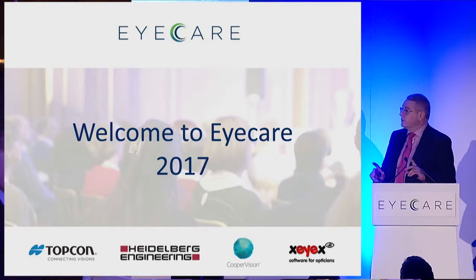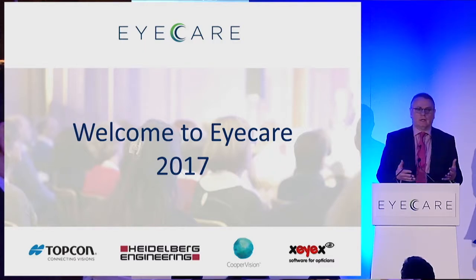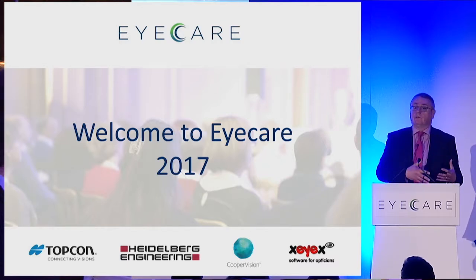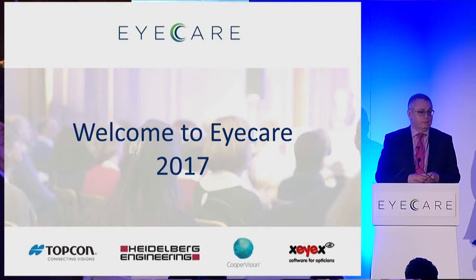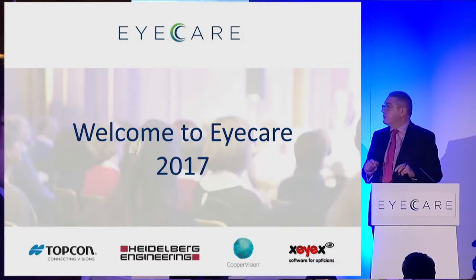Okay, so we're going to start out with our first live session. What we'll be doing is we'll introduce the patients to you. They will give you their history, their vision, signs and symptoms, and perhaps some initial investigations or scans. We'll then go through the live component and review what we visualized, and we'll then pose some questions for you to discuss in a round table format. We'll then review the images in a little bit more detail. Okay, so that's the basic format for today. So if we could initially just move over to the external camera, please.